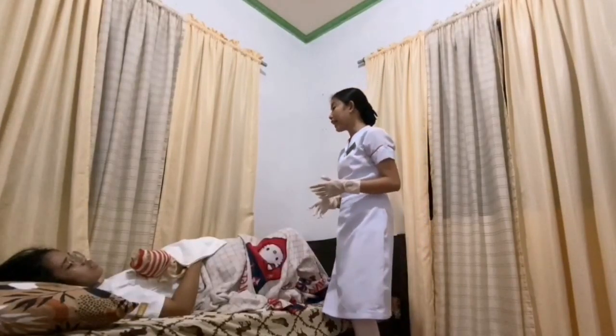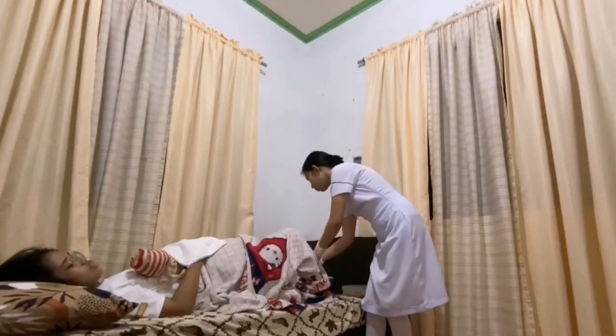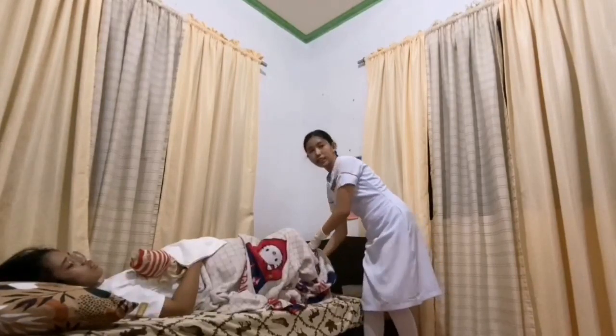After that is the fourth stage of labor, from expulsion of the placenta to a period of 1 to 4 hours after delivery. It is also the critical stage to watch out for postpartum hemorrhage, secondary to atony and lacerations. Repeat check every 5 minutes. Examine the perineum, lower vagina, and vulva for tears. So, as I have examined, there are no signs of tears, lacerations, cuts, nor episiotomy.